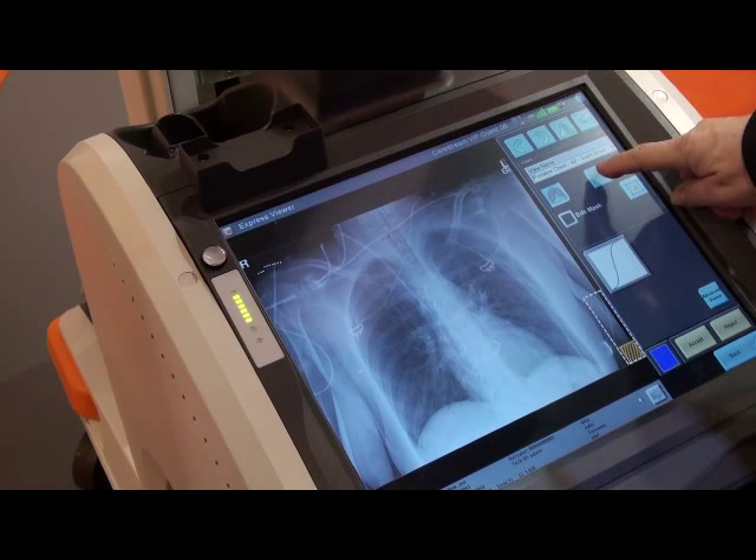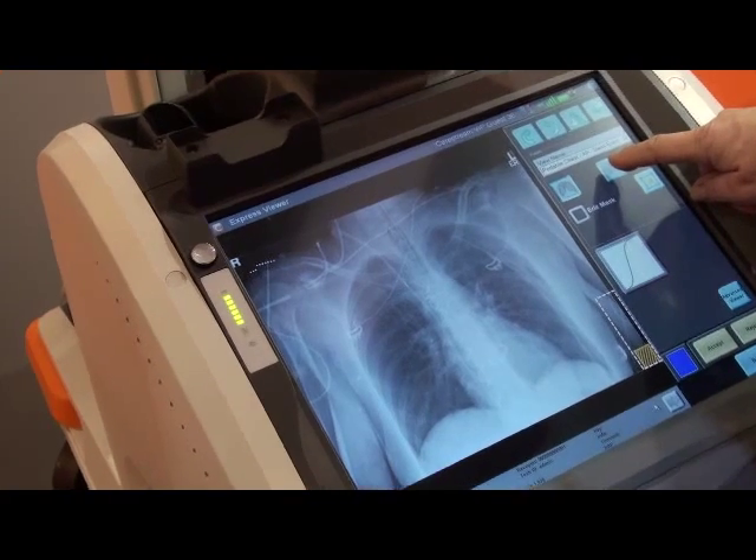The new DRX Revolution is going to offer high quality images along with the ease of use for radiographers as well.